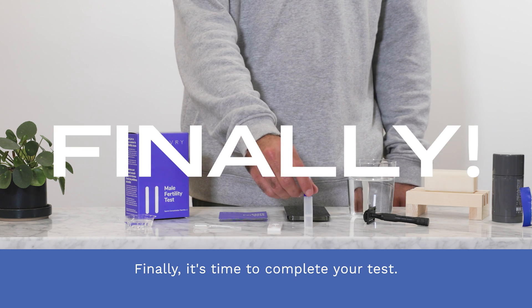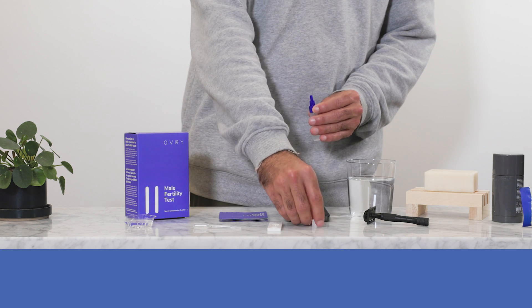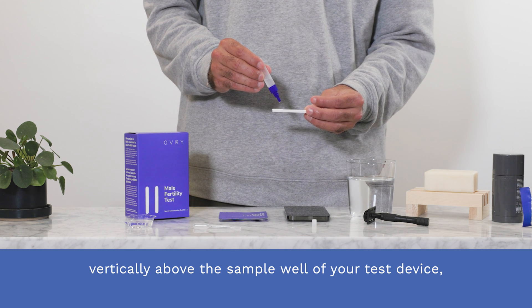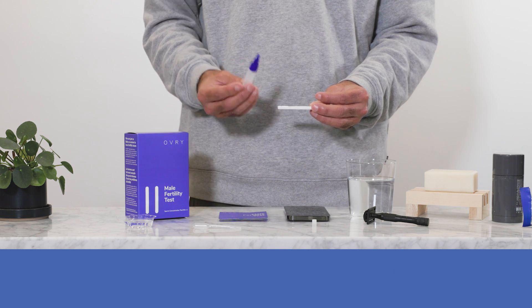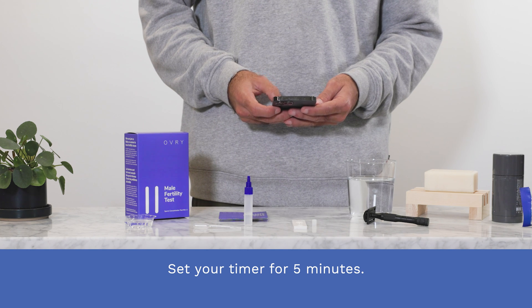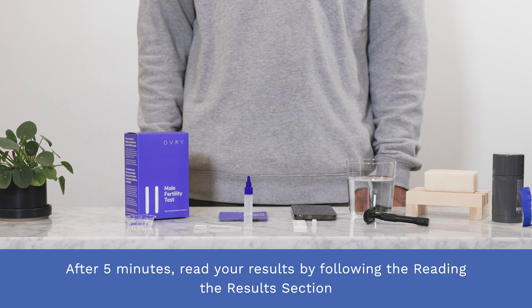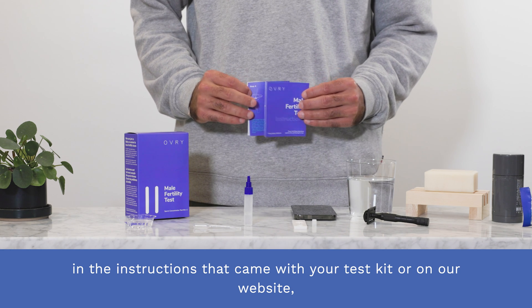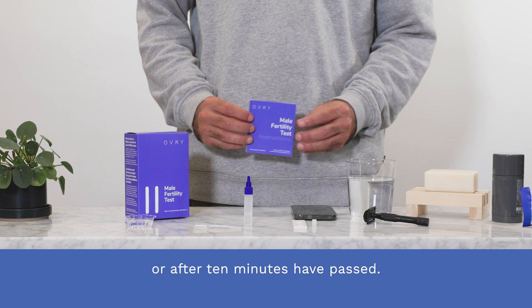Step six. Finally, it's time to complete your test. Unscrew the small clear cap from the collection tube. Holding the collection tube vertically above the sample well of your test device, transfer three drops of the mixture into the sample well. Set your timer for five minutes. After five minutes, read your results by following the reading the results section in the instructions that came with your test kit or on our website. Make sure not to interpret your results before five minutes or after ten minutes have passed. Happy testing!